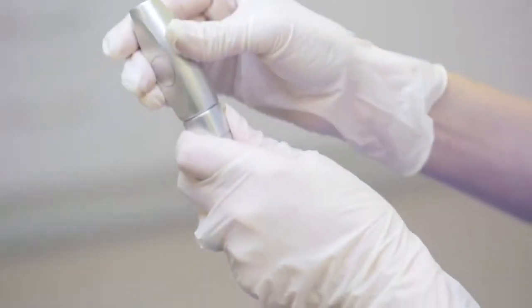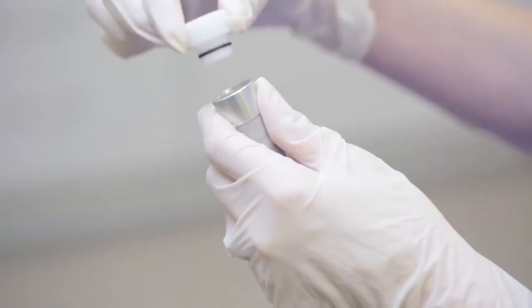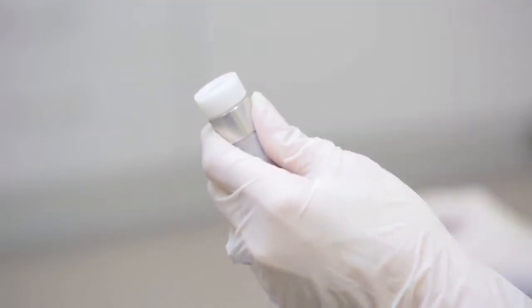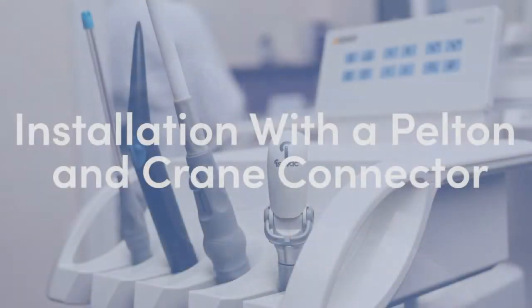To install, remove your existing valve from the HVE coupler. Attach the Adec connector onto the HVE coupler. Attach Isovac onto the Adec connector. Press firmly in place.